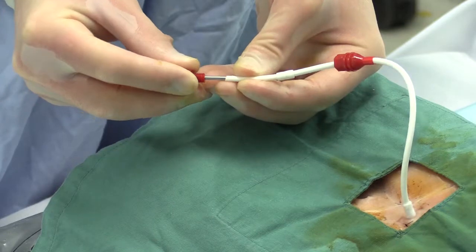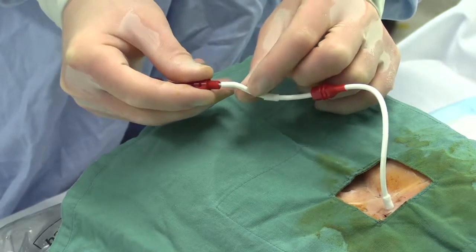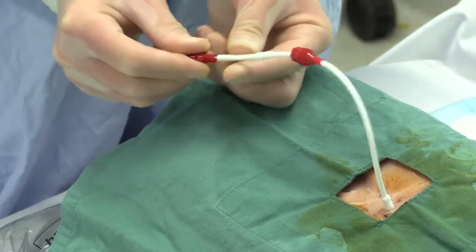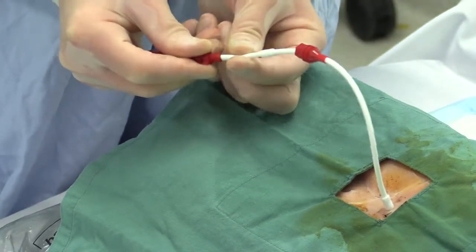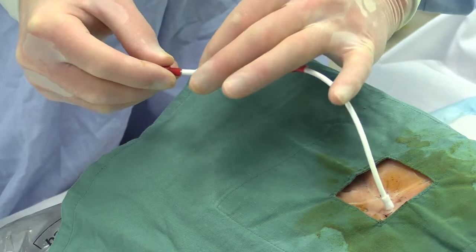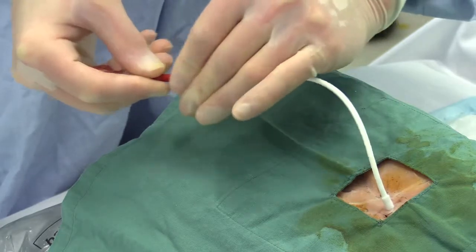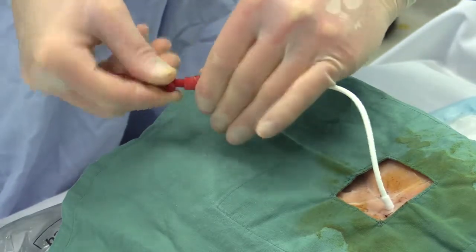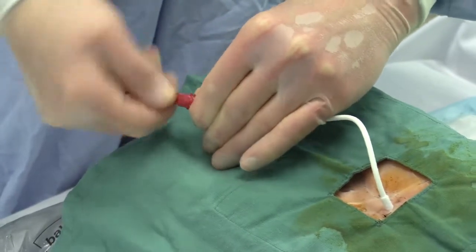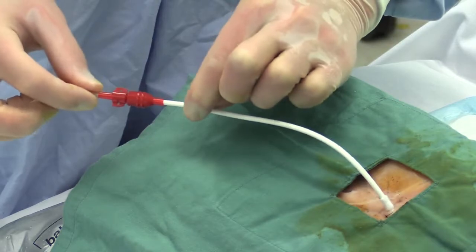Then the metal tubing is placed down the silastic tubing. Care should be taken not to create tears. It is very easy to buckle the silastic tubing over the metal tip. Push it in all the way up to the hub, demonstrated there, and the plastic tubing goes up a little bit higher, and the outer casing screwed back into position. This will secure the white silastic tubing onto the metal inner tubing in a very secure fashion.